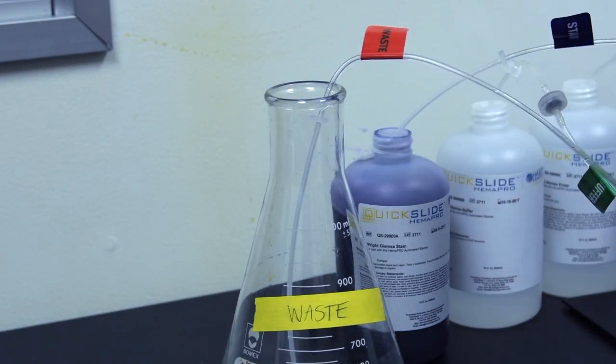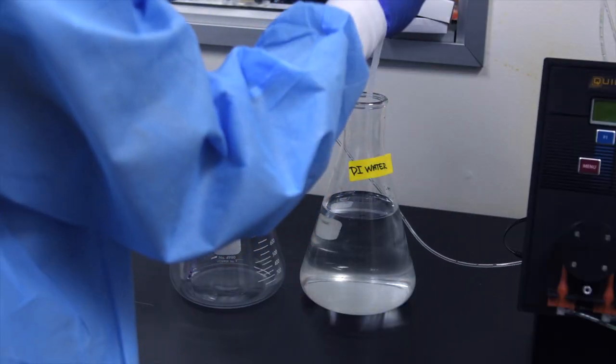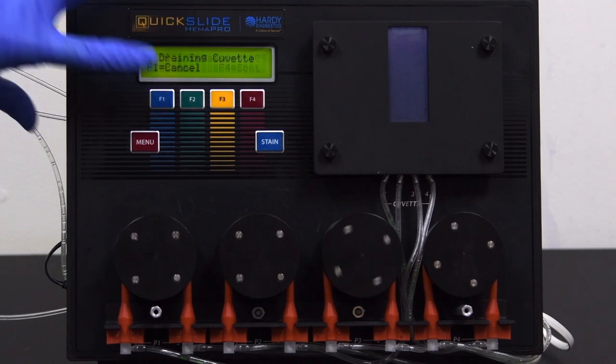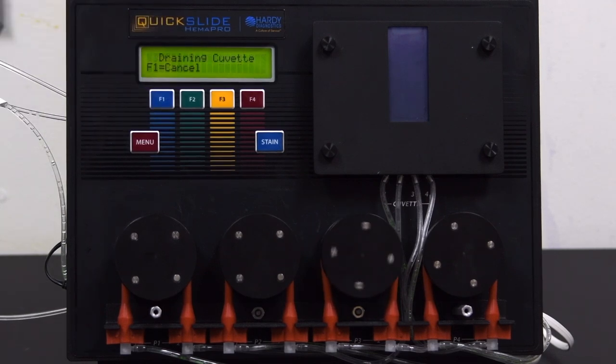Put the waste cannula into the waste container, and the reagent cannulas into DI water. Run two prime cycles to confirm that the tubing and cannula lines are correctly installed.